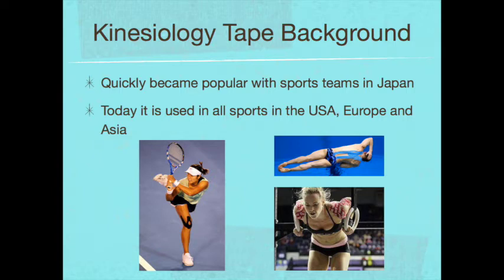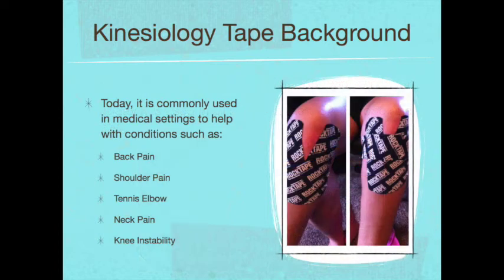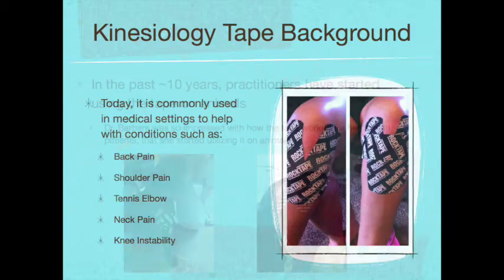Kinesiology tape quickly became popular with sports teams, especially in Japan where it was developed, and today you can see it in pretty much any sport in the US, Europe, and Asia. Today it's commonly used in medical settings as well to help with conditions such as back pain, shoulder pain, tennis elbow, neck pain, and knee instability, which are just a few of the reasons why you'll see people walking around wearing tape.